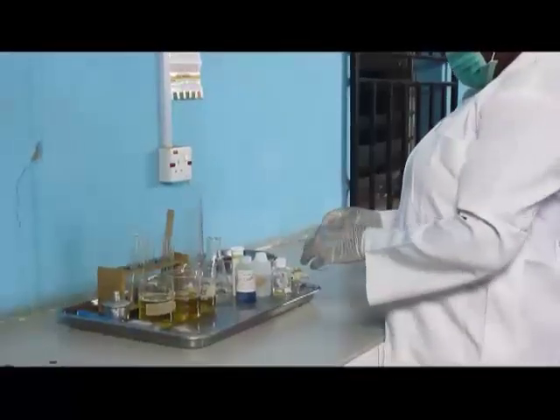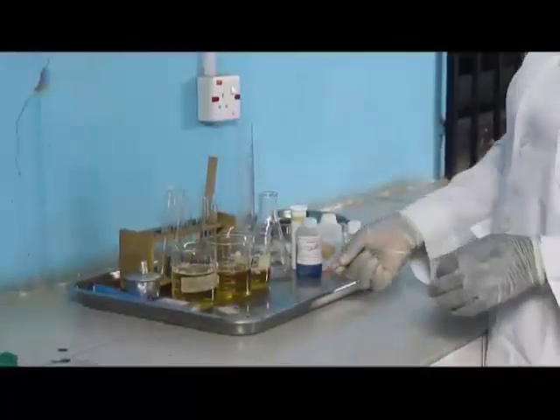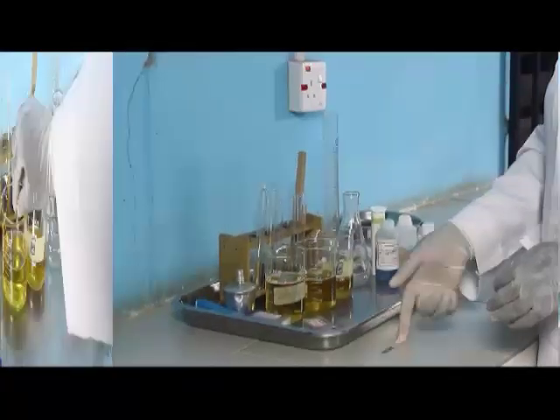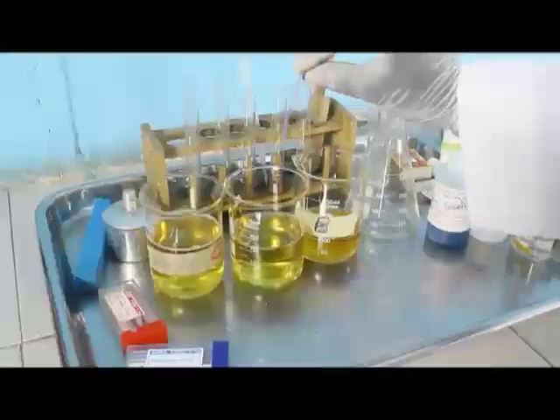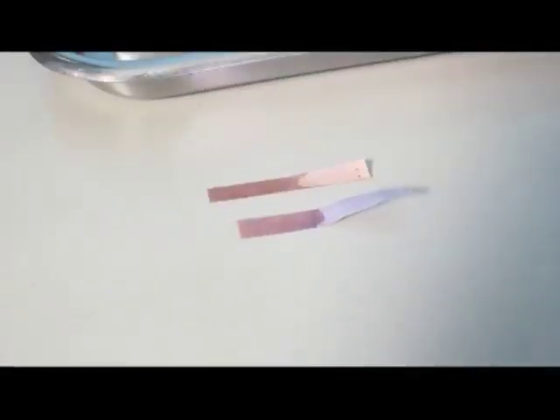To test for reaction, one strip of red and one strip of blue litmus paper are dipped into the urine, then observed for any color change. Acidic urine turns blue litmus paper to red. Alkaline urine turns red litmus paper to blue. If the urine is neutral, there will be no color change.